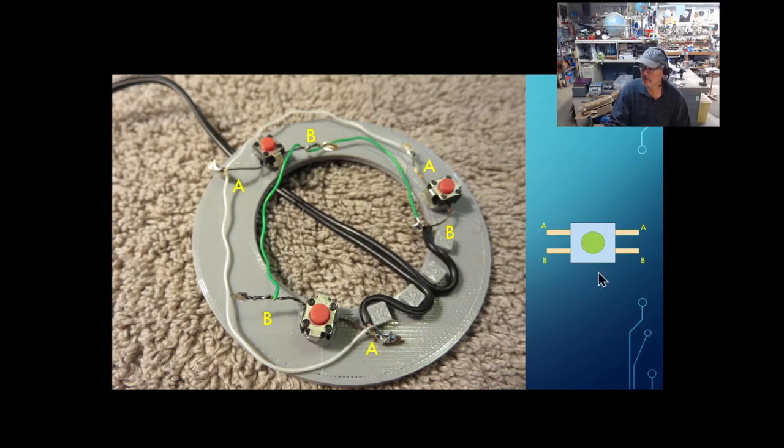Again, if you're using this particular type of switch, do the same thing. Hook the A's to the A's and the B's to the B's. If you hooked a wire, like green to one side of A, and white to the other side of A, that switch is going to be always on. It's just like twisting the wires together. You've shorted it out, so don't do that.